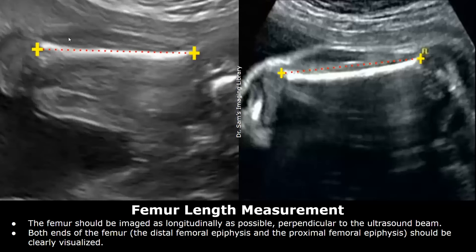Both ends of the femur — the proximal and distal femoral epiphysis — should be clearly visualized. The epiphysis is the end part of a long bone, the femur in this case.